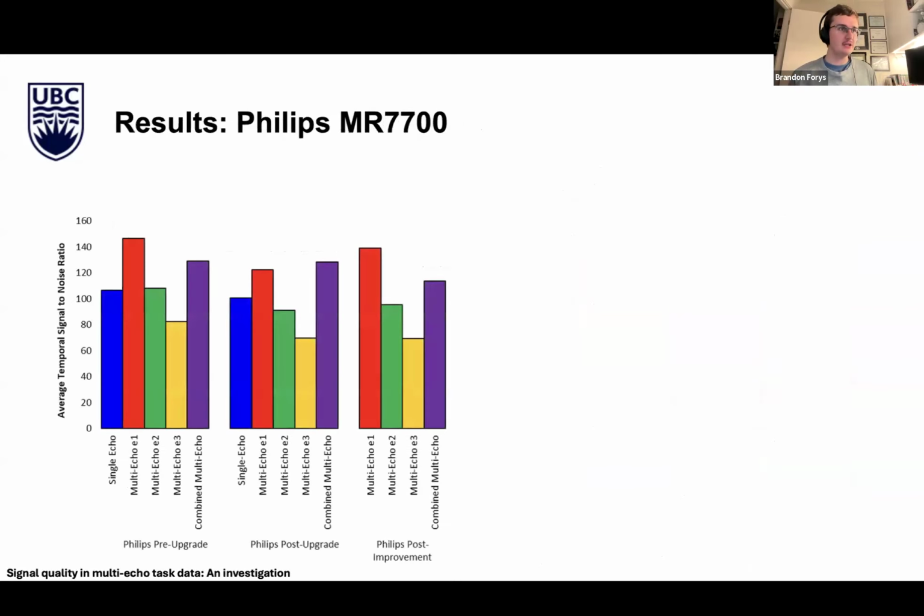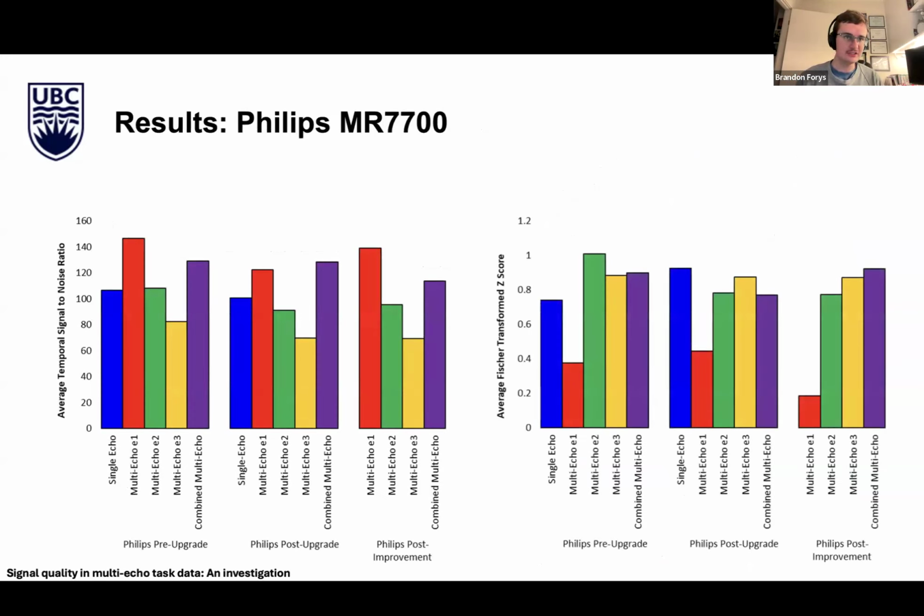What we observed is that you might expect the first echo, what you're seeing here, to have the highest signal to noise ratio, which I guess is the property of the early echoes, as you might see when you're looking at your multi-echo denoising. But what was interesting to note was that the first echo also had the worst recovery of the canonical networks associated with the working memory task.